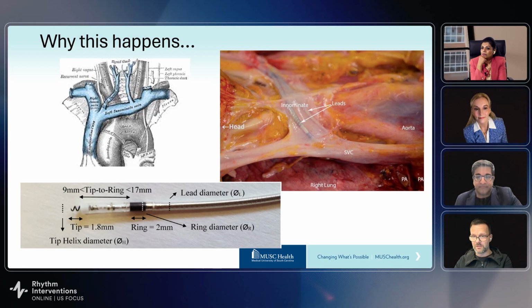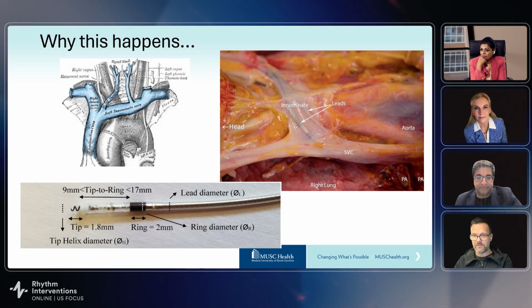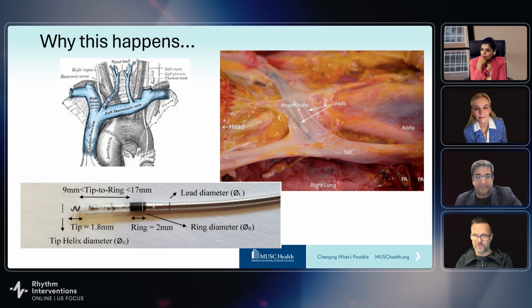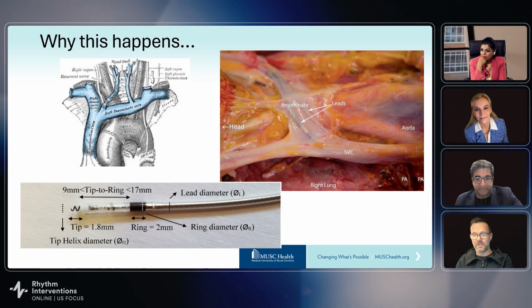Yeah, I've certainly seen leads get stuck in this position. I've also seen them get stuck more proximally. If we think about where we typically see venous stenoses, it's more proximal to this. And so when you pull a lead back and it frees up and it makes this turn, you think you're out of the woods, and actually then it'll get stuck just at the venous entry site. If you're not prepared to go all the way to take that lead out, I don't think you should be pulling on it necessarily.